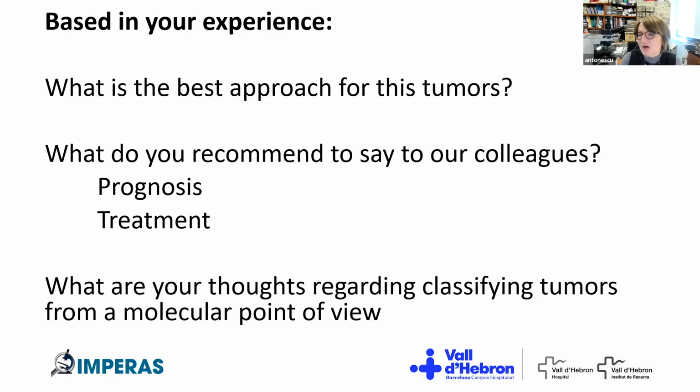So that's one reason I wouldn't go there, knowing that we now have a different entity defined by this fusion. It has an epithelioid morphology, expresses cytokeratin, and has dual features of angiomatoid fibrous histiocytoma in some of our cases, with lymphoid aggregates and cystic changes, and then the relationship with the mesothelial lining, that would suggest, as you said, an epithelioid mesothelioma.